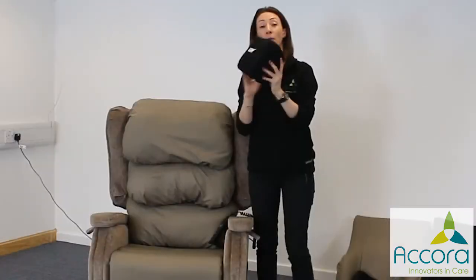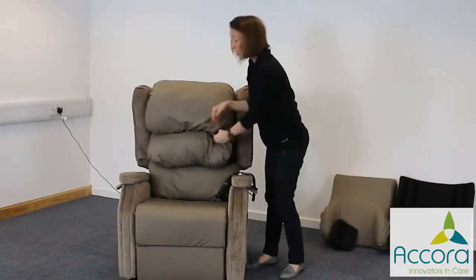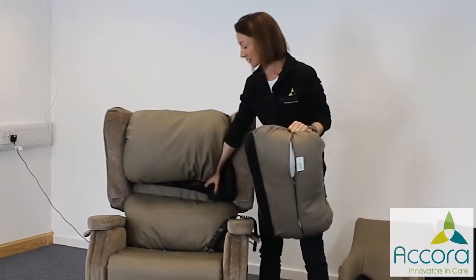However, that may not be enough, and we may need to provide a little bit of a prompt. We can do that by providing these lateral wedges. Just by having that on the side, it can give a person a little bit of a prompt and enable them to maintain a good position in the chair. But it may be that they need a little bit more pelvic stability, and so we remove these cushions and we replace it with a lateral support backrest.